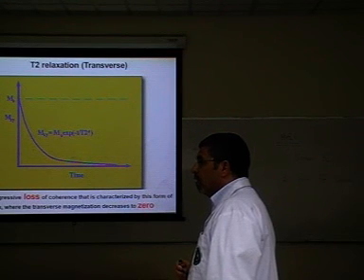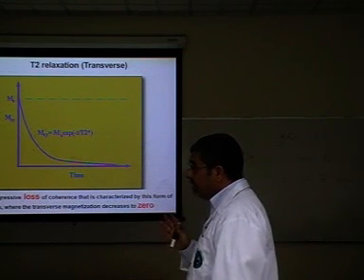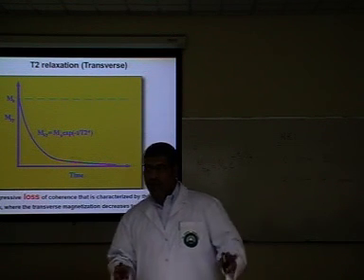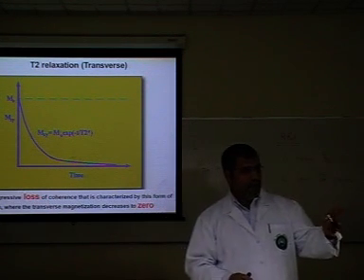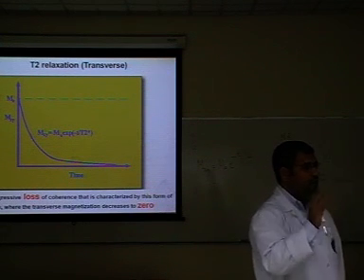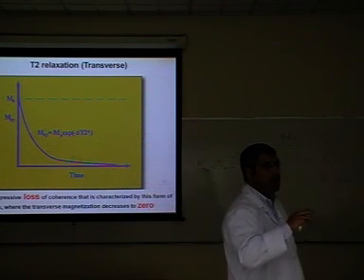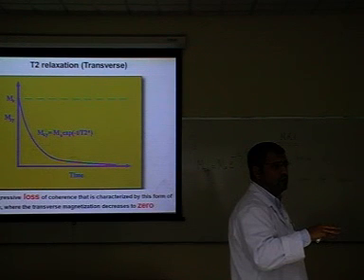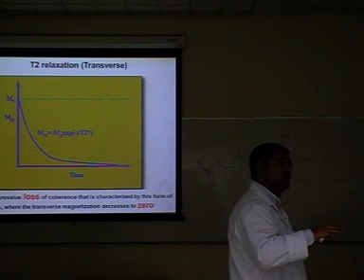The magnetization will go to the excitation state. You guys are a little bit sleepy today. Then when you remove the RF signal, it returns back.